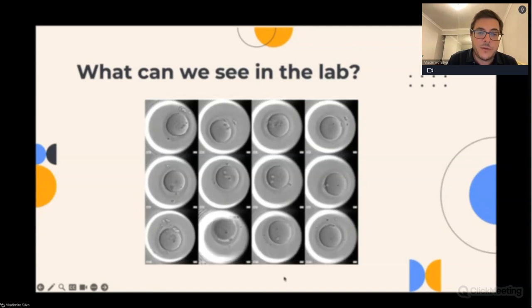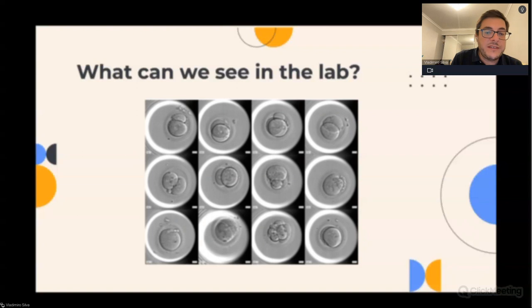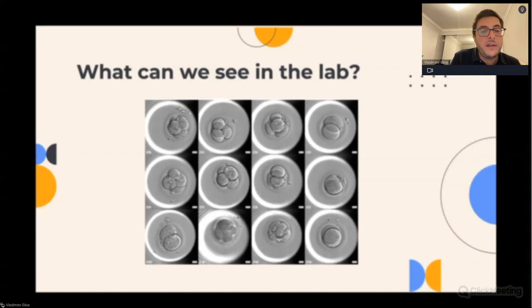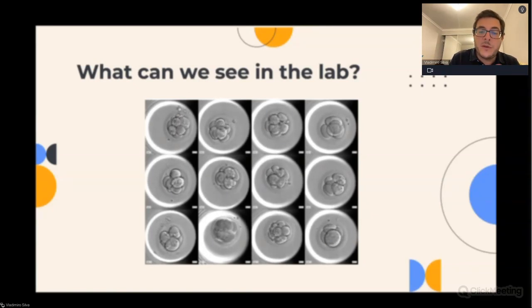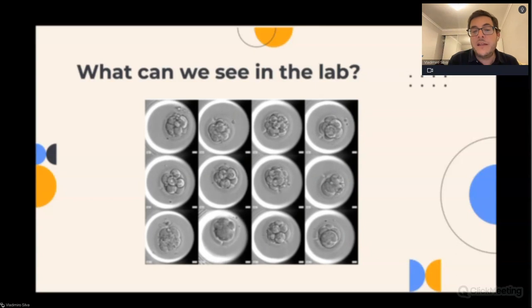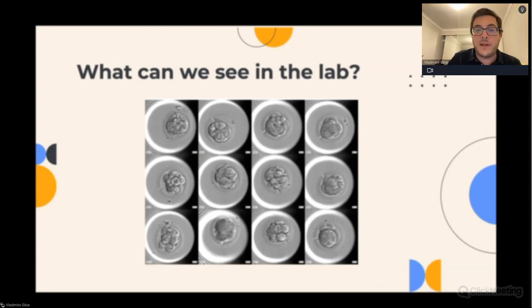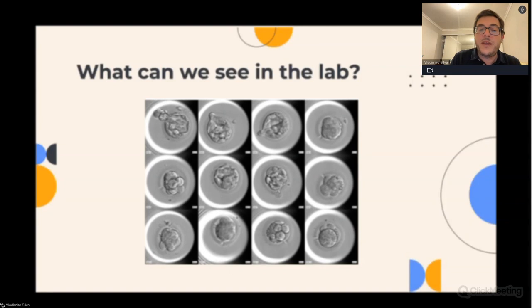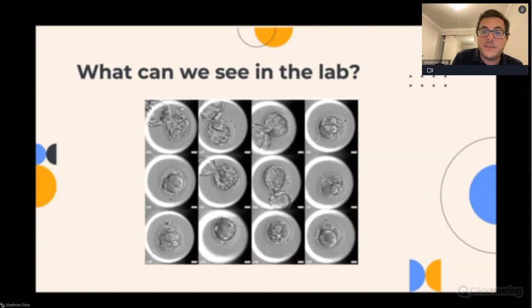What happens with these embryos is extremely difficult for the human eye to see, so it took science a lot of years to really understand the meaning of all of these cell divisions: whether a cell divides into 1, 2, or 3, whether the division is symmetrical, whether the cells have just one nucleus or multinucleation, whether there are fragmentations in the embryos, and how much time it takes from 2 cells to 3 cells to 4 cells to 5 cells, and so on. How is the embryo developing? Is it including all the cells inside the embryo, or is it excluding some of the cells?